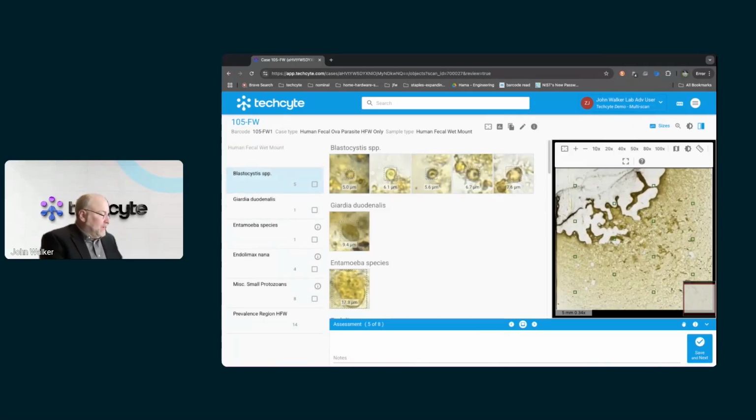This last one here that I wanted to show you of the single wet mounts is, you say, well, you've talked about not trusting the scan. You can see from this overview image that this is probably a high debris content sample, and it dried out before we could get a good scan from it. We developed a proprietary mounting media along with ARUP that preserves the samples for longer than is typically seen with wet mounts.